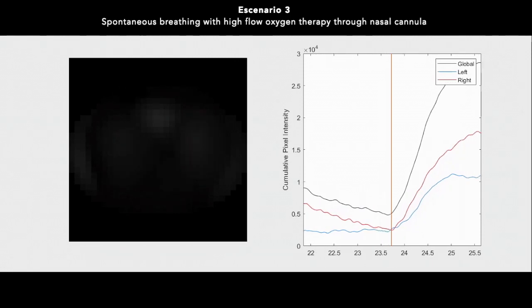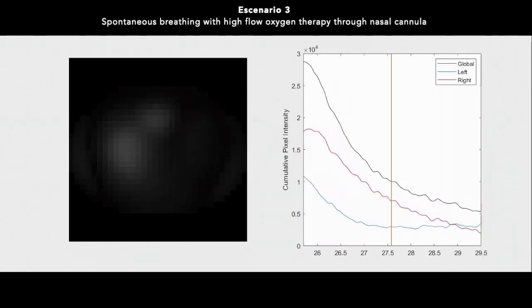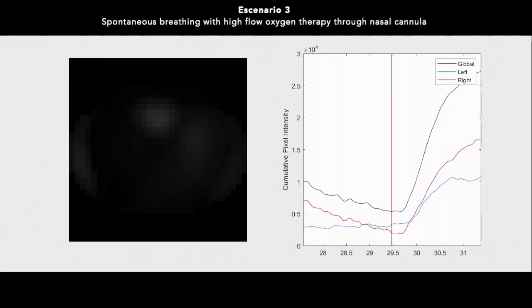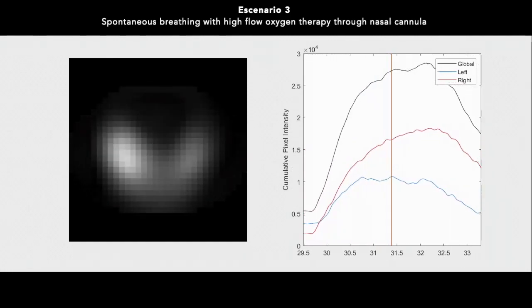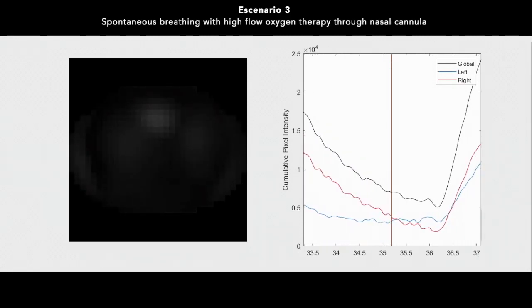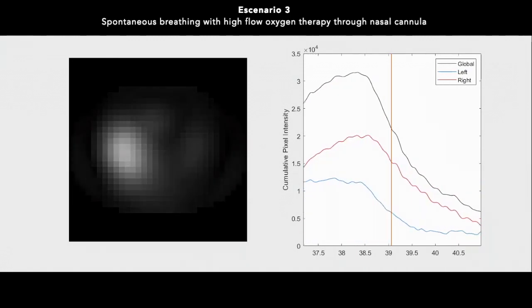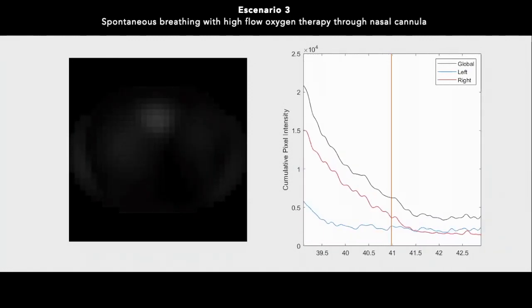Electrical impedance tomography is a valuable tool for physicians in monitoring regional ventilation in patients with varying lung compliance in each lung. By utilizing electrical impedance tomography, physicians can accurately assess the ventilation patterns and make informed decisions regarding the most suitable therapeutic option for these patients.